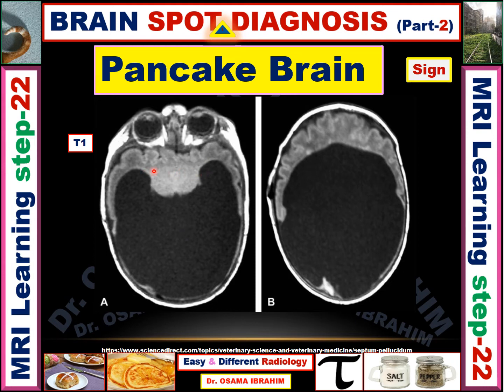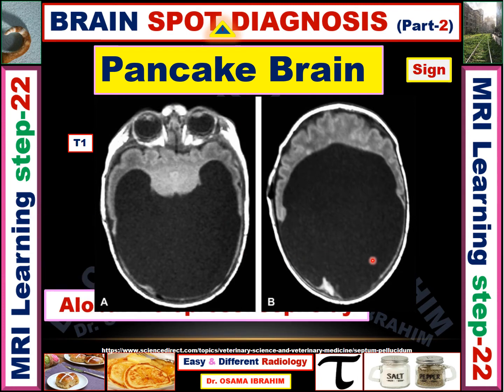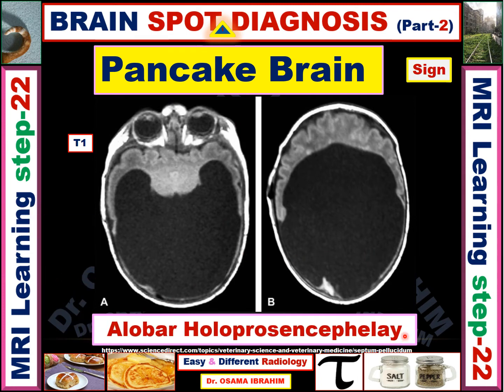The pancake sign is represented due to fusion of the cerebral hemispheres on both sides. There is no inter-hemispheric fissure as you can see, and also the ventricles have no septum pellucidum or midline structures. The ventricles are fused together to form a monoventricle. This pancake appearance is called the pancake sign. In the pediatric age group, the pancake sign represents alobar holoprosencephaly, appearing as a pancake brain due to fusion of the cerebral hemispheres and ventricles.